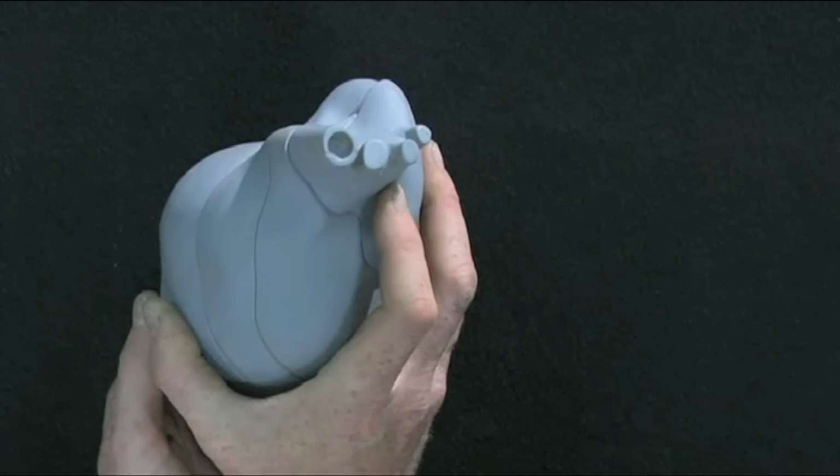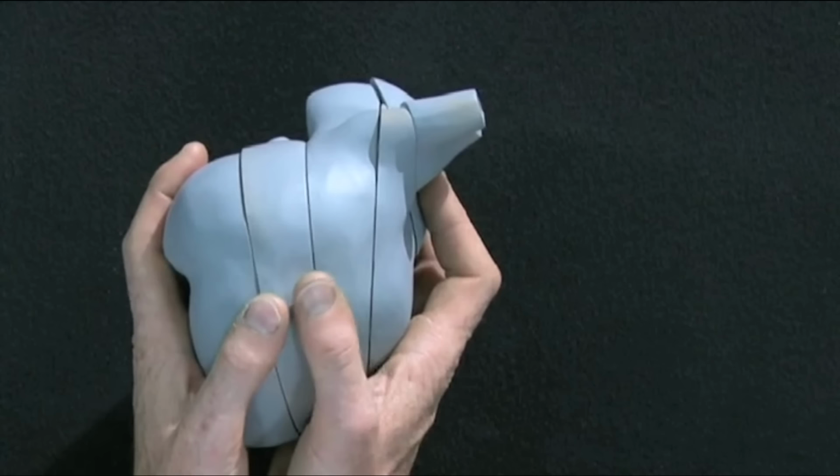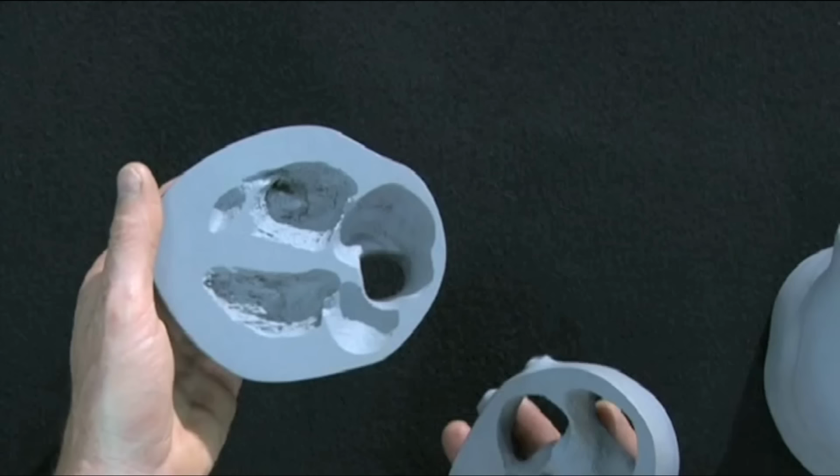Coming on to look at how these structures relate to the model, first of all, each slice, if this was a real fetal heart, would be a mirror image above and below the slice. The way I've made the model is to show a range of normal depending on artifact and position. So as you can see, this is the four-chamber view as would be seen with the scan beams appearing more or less perpendicular to the fetal heart.